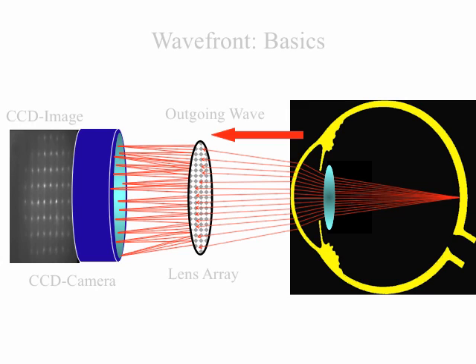Now, if those converging rays of light pass through our little piece of cardboard with the 1 millimeter spaced apertures, what will the pattern be projected on that little black sheet of paper? Well, this is an ideal myopic eye, so they're still all going to be equally spaced, but will they be more closely packed or more spread out than the 1 millimeter grid on the disc that is between the eye and this black sheet of paper? Given a little bit of thought, you should see that the little spots of light will be more closely spaced. They're more closely spaced because the rays of light passing through each of these holes are converging, and they'll converge towards this black sheet of paper, and the result is that the pattern, although regularly spaced, will be more tightly packed, and similarly with a hyperopic eye, will be more spread out.